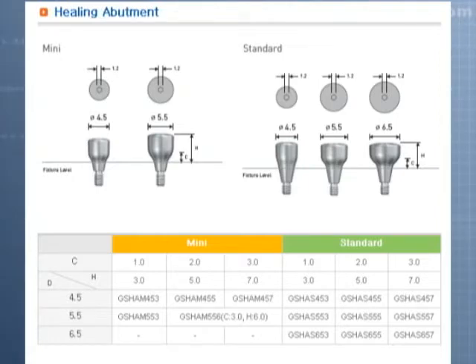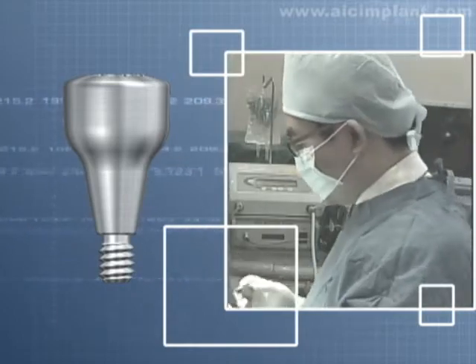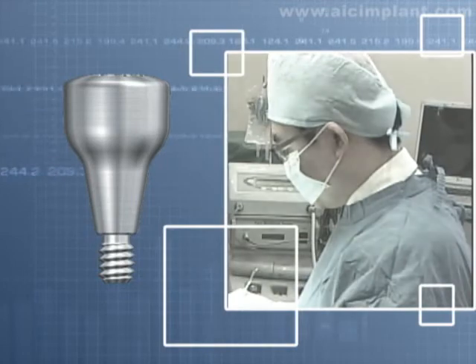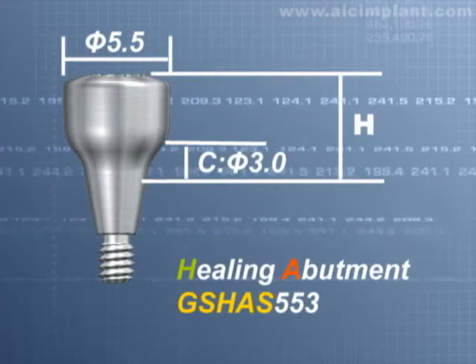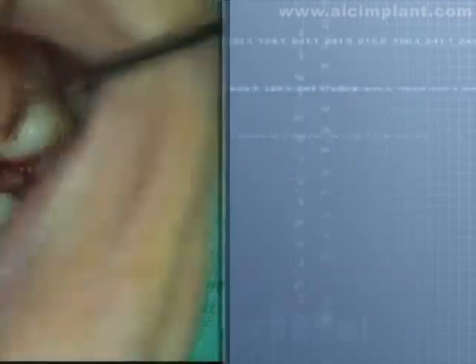One of these is the patient chewing the healing abutment. This can cause the healing abutment to loosen and deform. Thus, choosing one that is equal to the gingival height is recommended. At this gingival height, we can use a 553 or shorter healing abutment.